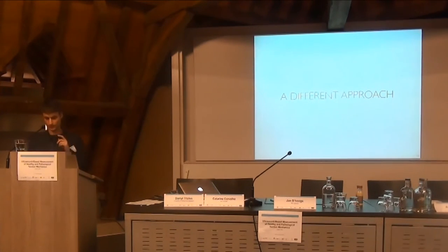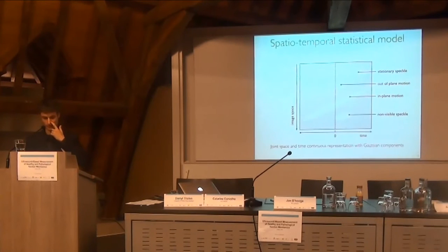So I try a different approach. And it's based on the following characterization. Here you see a line profile of a 2D image. This is, for example, a vertical or horizontal line profile, and you see the intensity, and here you see the time dimension. If you observe that your intensity does not change for a steady time, that means that the speckle is stationary.